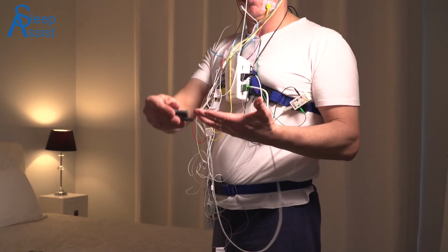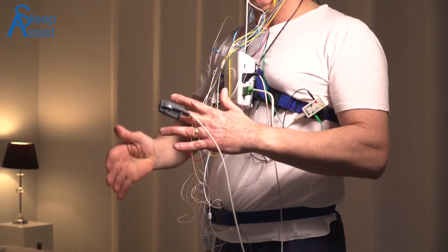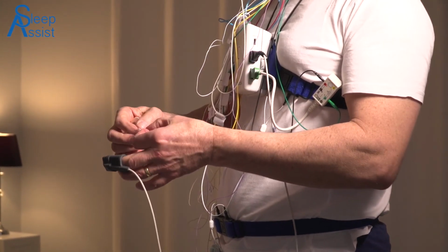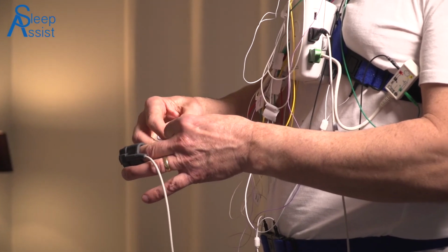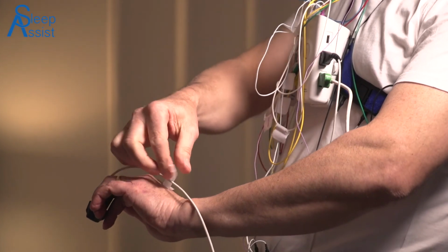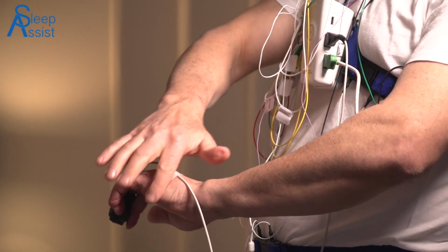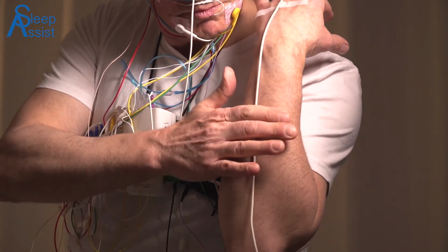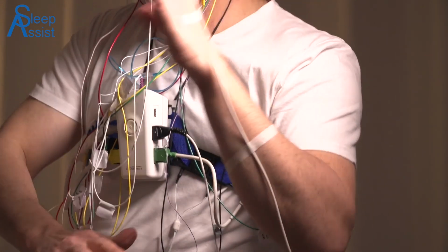Place the rubber pulse oximeter around the middle finger of your non-preferred hand. This means if you are right-handed, place the cap on your left hand middle finger. Run the lead over the back of your hand and tape it securely there. Also tape the lead halfway up your forearm. The pulse oximeter may already be plugged into the PDX unit.